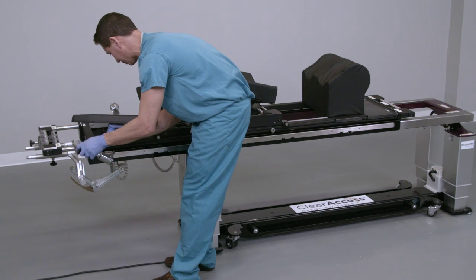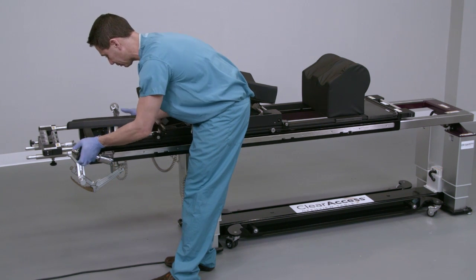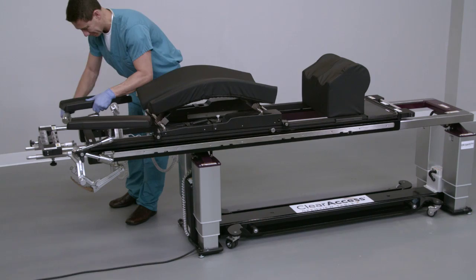Once the lock is attached to the side rail, move the arm board to the desired position and secure in place by tightening the large black knob at the elbow of the arm board. Repeat these steps to install the opposing arm board.